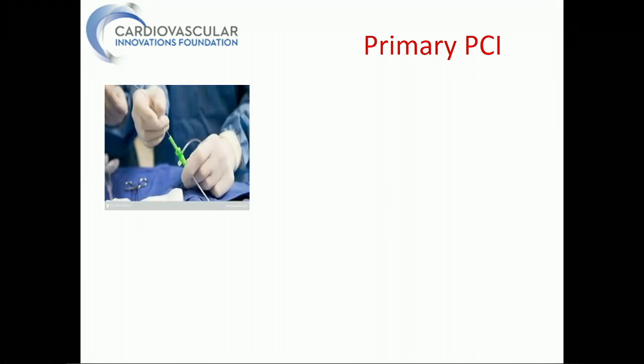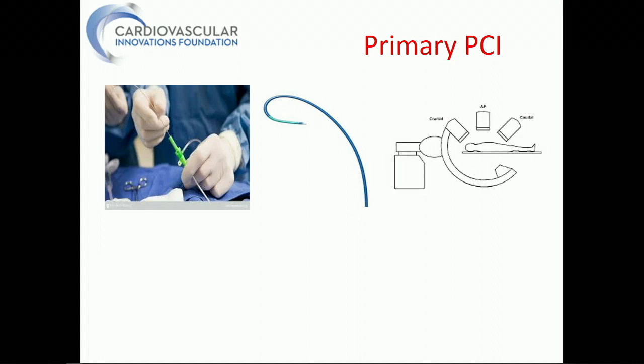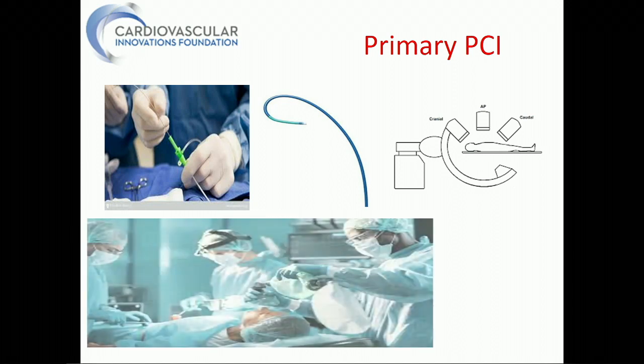Firstly, we went for the femoral approach, and the femoral pulsation could be felt by the chest compression and by anatomical location. We went for an XB catheter to cannulate the left main according to the ECG diagnosis. We will notice that most of the angiographic views in this study will be in the RAO cranial view, which was the most suitable angiographic view for both the rescuers and the operator.